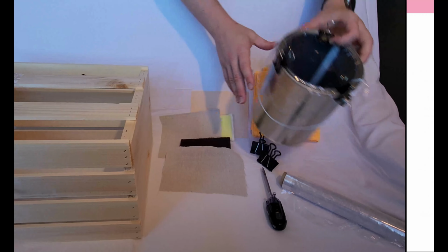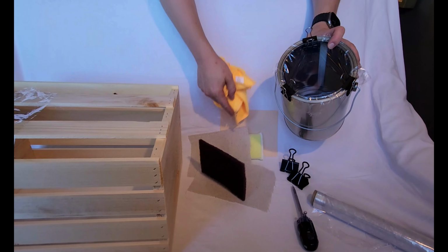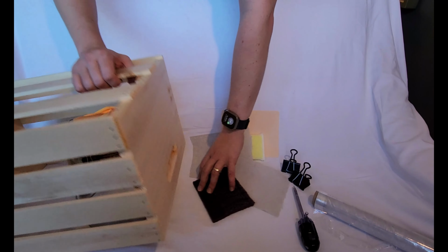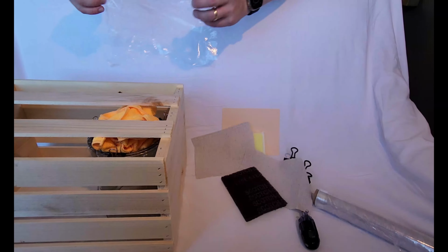We will begin building our simulation by attaching the plastic wrap to the top of the paint can with clips. Next, we will place the microfiber cloth on top of the paint can and place it beneath the wooden crate to represent the underlying omentum and bowel.